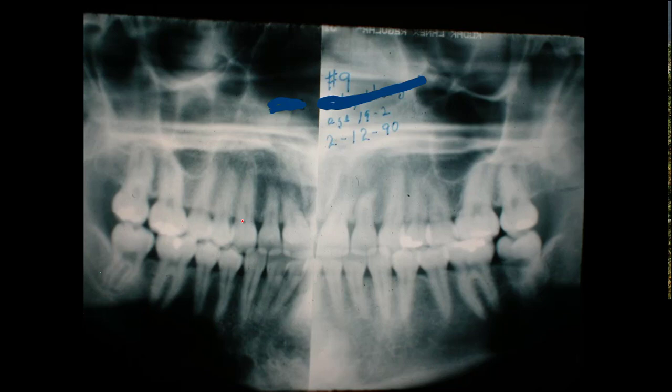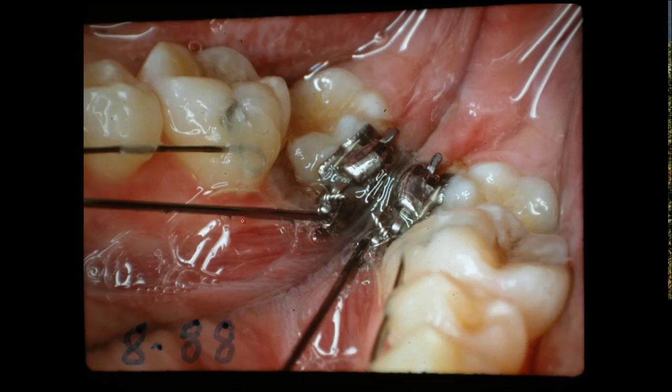Now I'm going to go through the case clinically and show you pictures of the teeth. You do have to learn how to use electrosurgery or lasers. I've tried two or three different lasers — they're so darn slow. I can take electrosurgery and cut this tissue out of there while you're thinking about it with a laser. You don't have a bracket on there so there's no metal. You can just whack this tissue out of there, clean this tooth up a little bit, get it dry, etch it, and then bond your tube. This is just a tube bonded on the side of this tooth.